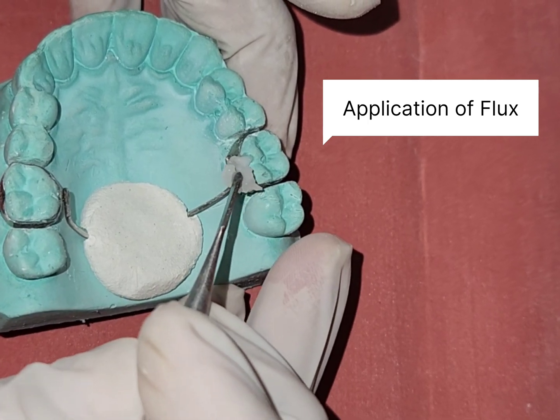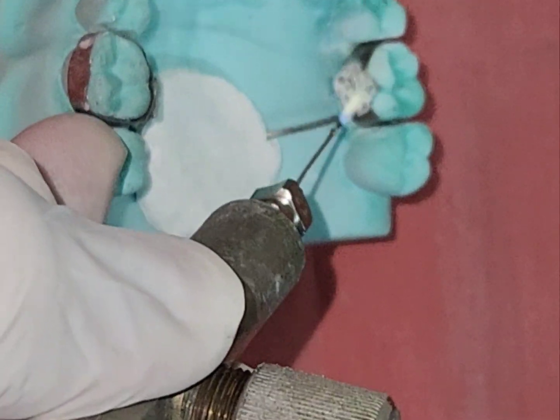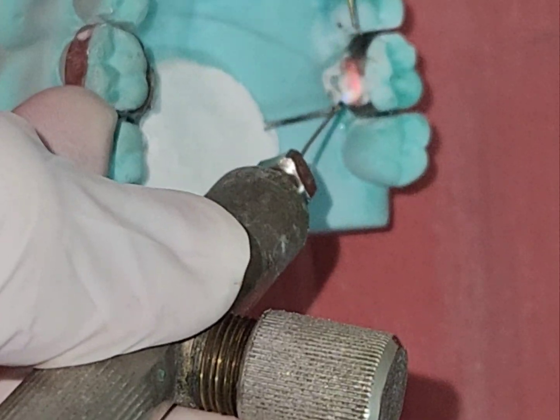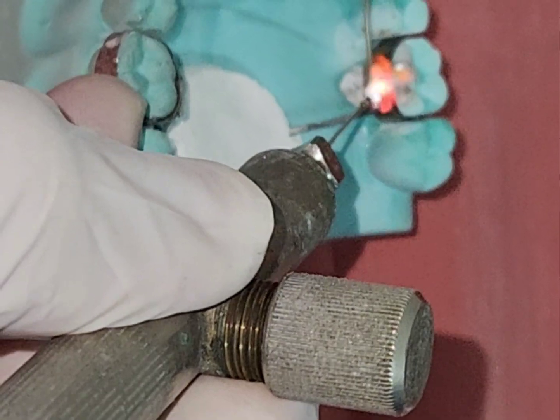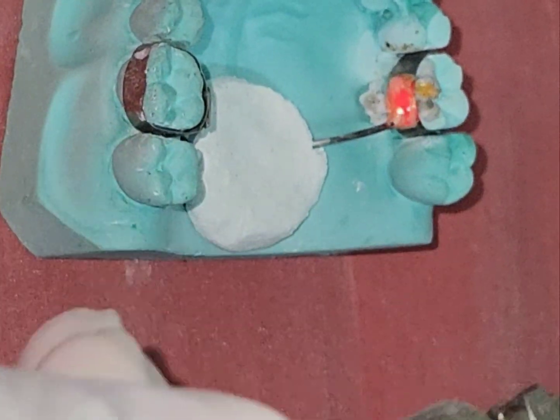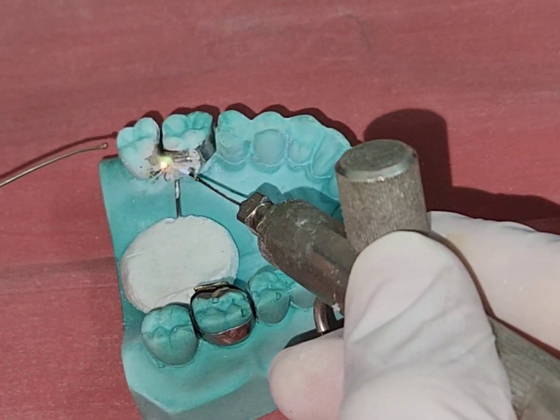Flux is applied in the area of the future solder joint. We are using the freehand soldering method, which is commonly used in orthodontics. The reducing zone of the flame is used to melt the silver solder, allowing formation of the solder joint. The same procedure has been performed on the other side.